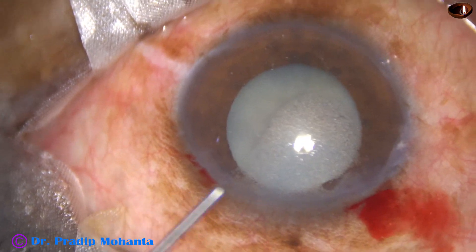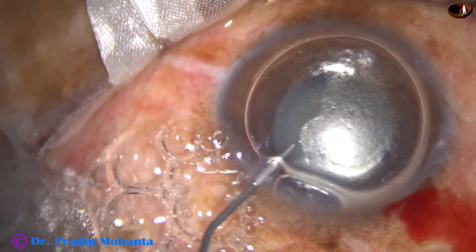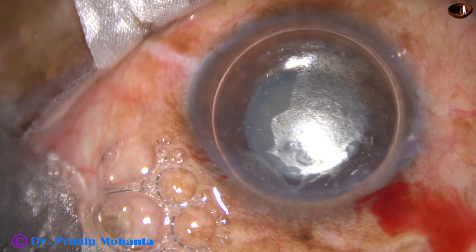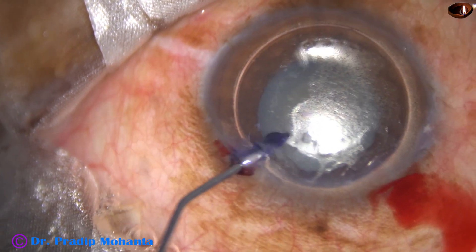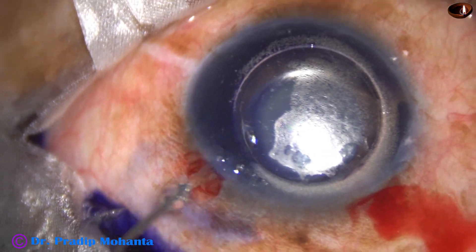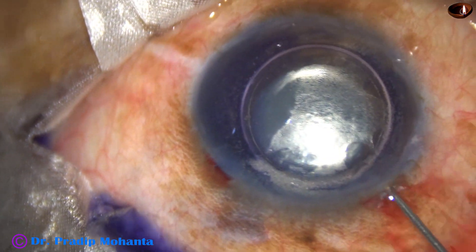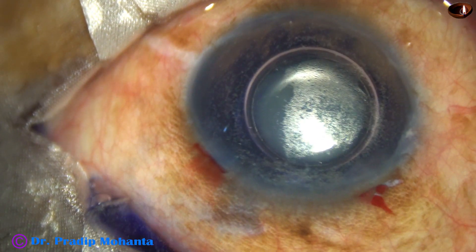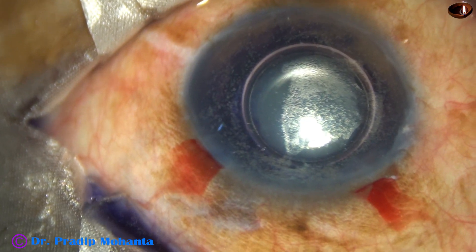Now I inject an air bubble. I want to stain the anterior capsule with trypan blue dye underneath this air bubble. Here goes the trypan blue dye. And now the dye as well as the silicon particles in the anterior chamber is thoroughly washed out with BSS.